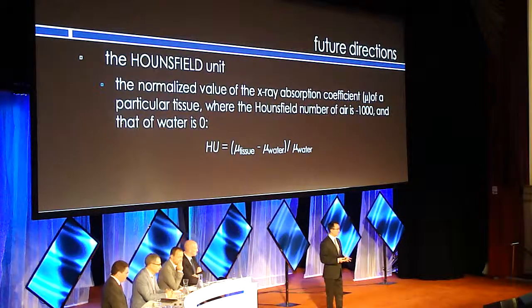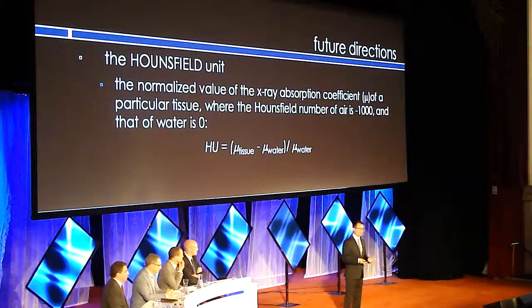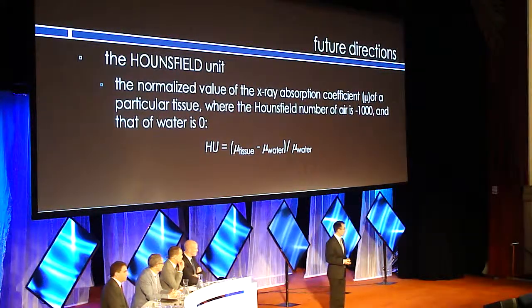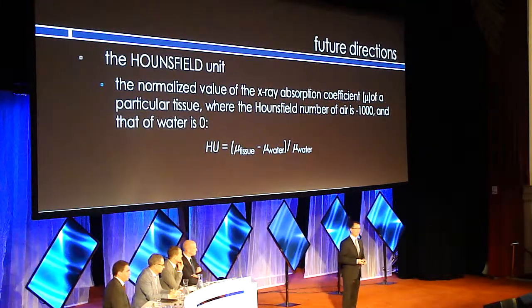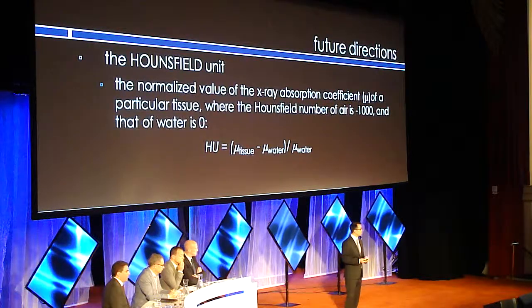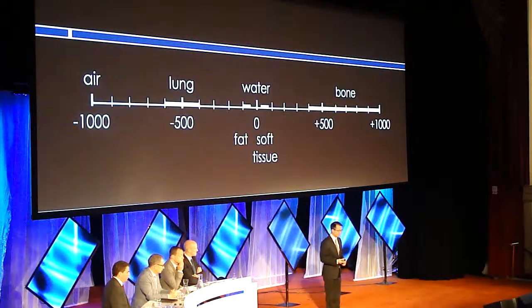In the day when medical CT was first invented, a fellow named Hounsfield was the fellow who was on the ground floor who invented these systems in England. The density measurement for different tissues in the body has a number that is associated with it, and that's named after this fellow Hounsfield. And these are called Hounsfield units. The Hounsfield unit really represents how different tissues absorb radiation, and you can calculate it out mathematically quite easily.